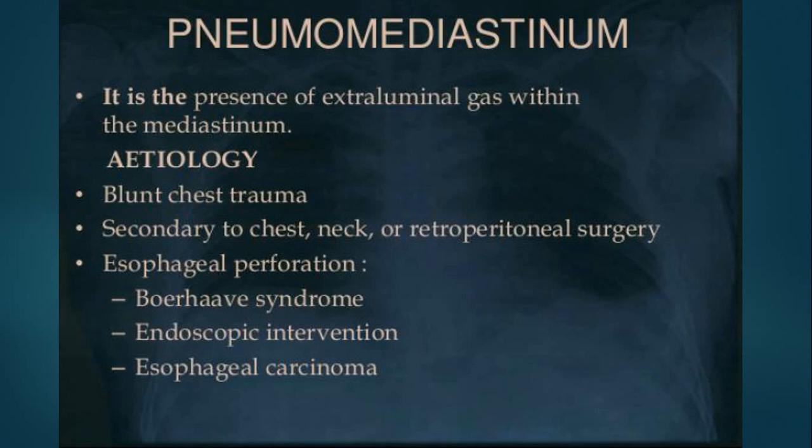For example, if the patient has achalasia and they are trying endoscopic dilatation, the esophagus might rupture and cause pneumomediastinum. Also, esophageal carcinoma can be a cause if it perforates and causes a leak of air.